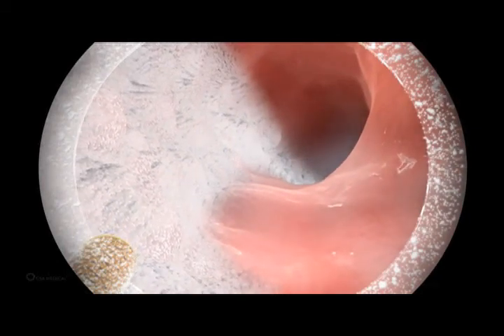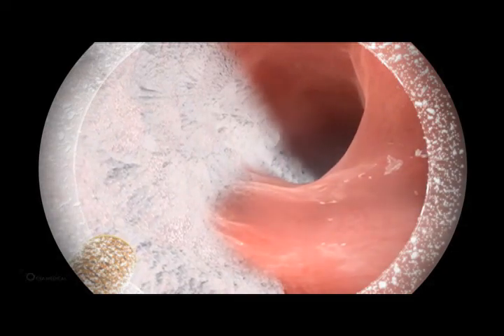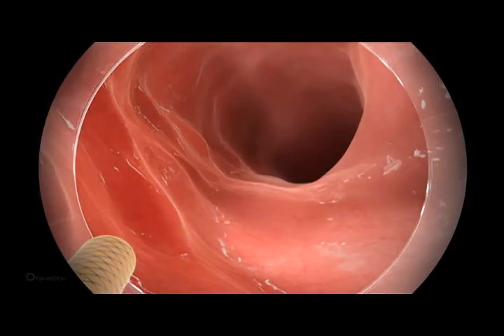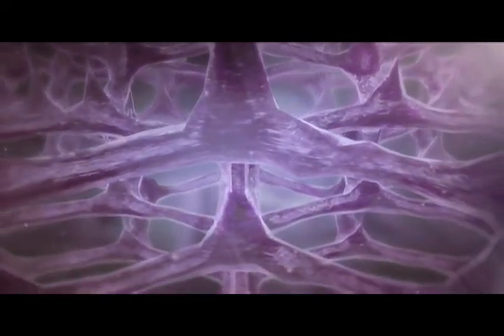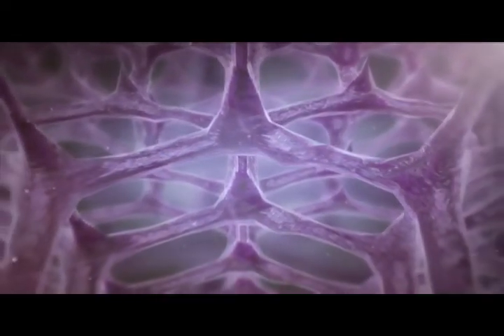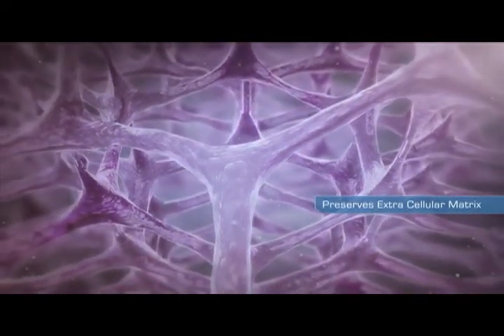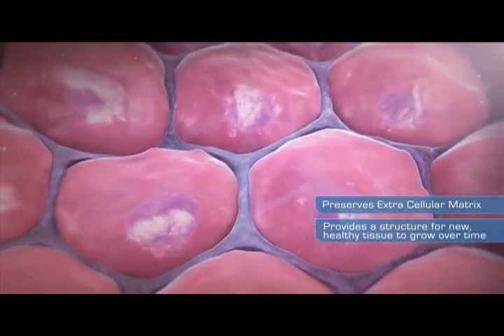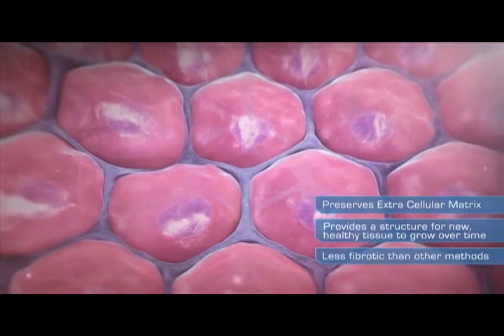After achieving a visual cryofrost for a predetermined amount of time, the cryospray is discontinued and the ablation area is allowed to thaw via natural reperfusion. The combination of a liquid nitrogen flash-freeze and slow thaw destroys cellular components while preserving the extracellular matrix, or stroma. This matrix provides a structure for new, healthy tissue to grow over time with a healing response that is less fibrotic than other methods.